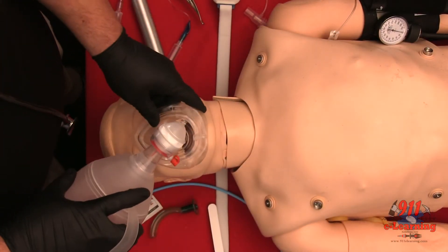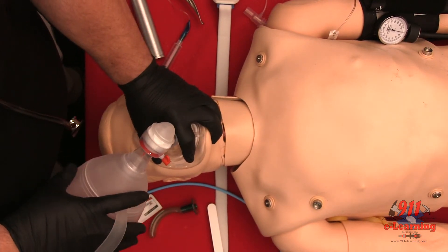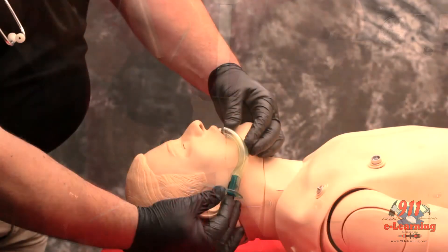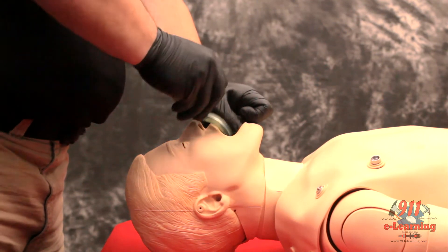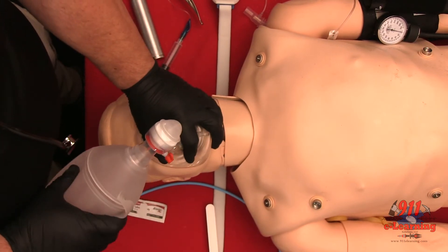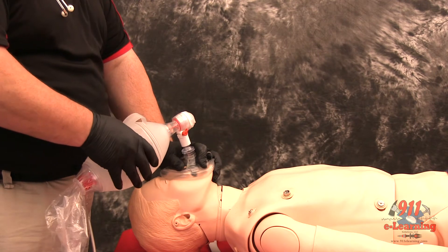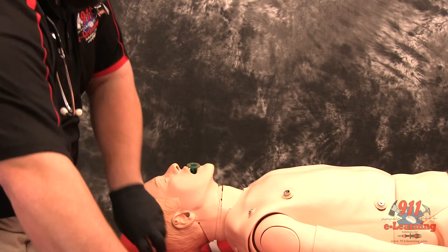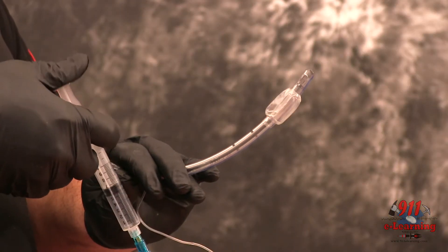Prepare, position, and oxygenate the patient with 100% oxygen. Select the proper ET tube without stylet, test the cuff, and prepare suction.